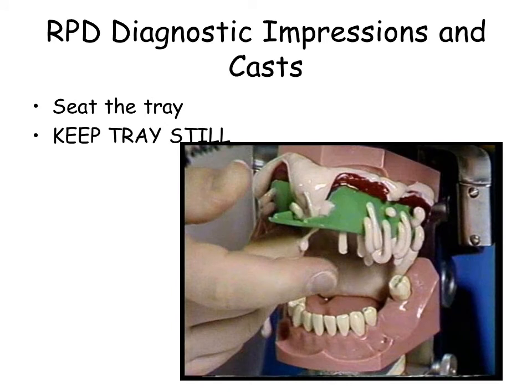Seat the tray. Hold the impression still until the impression is set. Notice the extrusion of material through the holes in the tray. This helps to retain the impression within the tray.